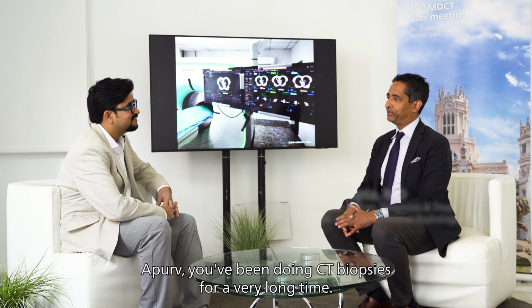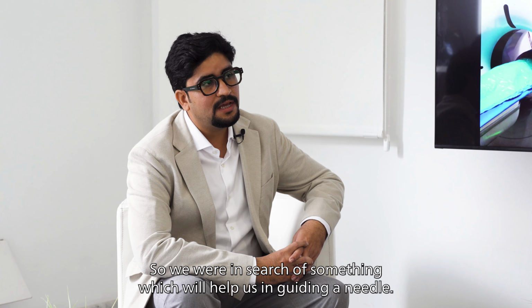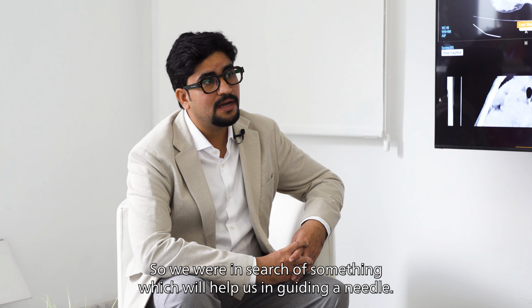So you want something faster? Yeah, fast. And more precise. So how are you using precise intervention to solve these challenges? So we were in search of something which will help us in guiding our needle. Suppose I'm not doing intervention, some newcomer is going to do the intervention. It's always dependent on the experience level of an interventionist to guide the needle, because it's a subjective job. But if you have something which will help you to see what is the deviation of your needle, what is the angulation of needle, what is the tip to target distance which is required, it is quite helpful.